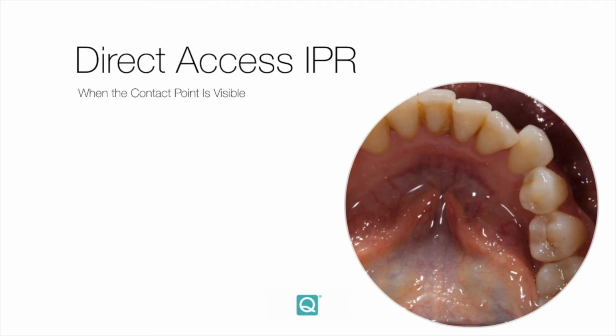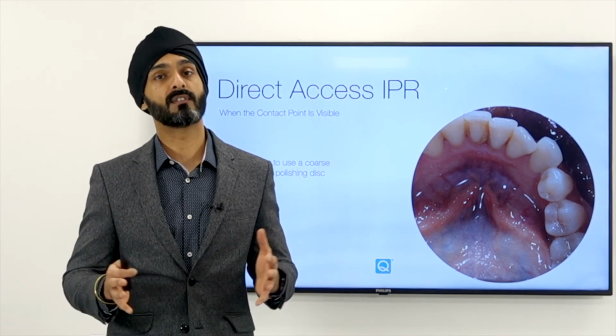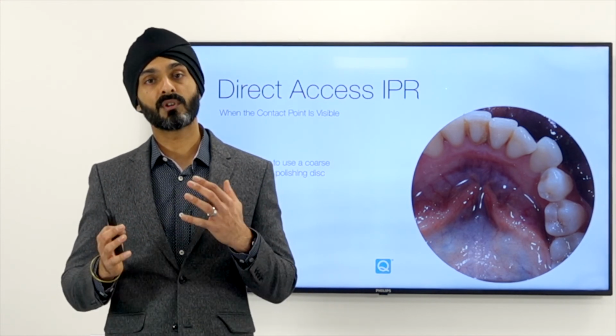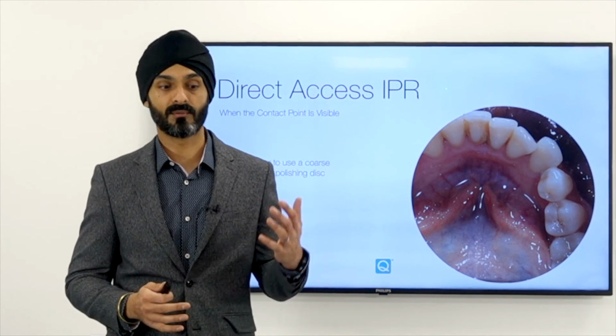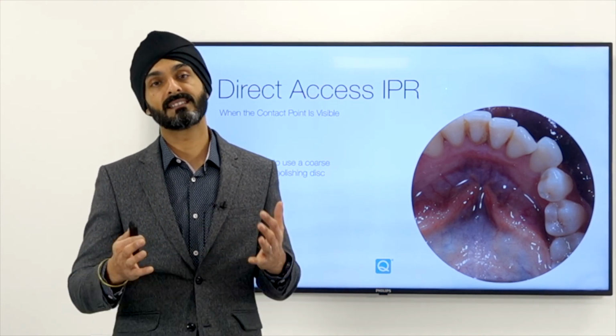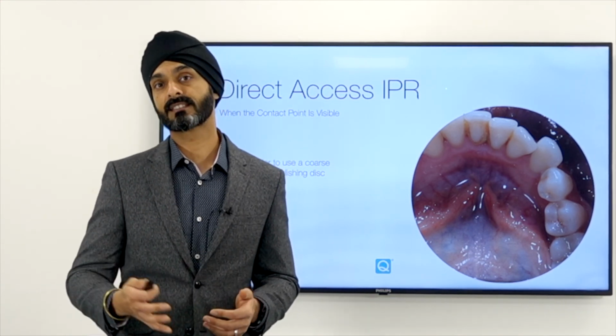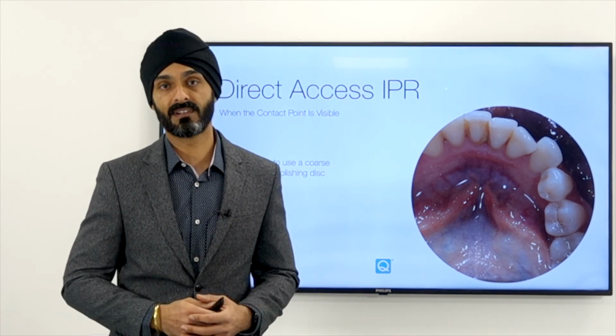When you've got a contact point which is completely visible, like on this lower right 3, it's easier to use a coarse polishing disc to adjust the contact points of that tooth rather than using a strip. So when you do this, it's a good idea to use a full series of the soft flex discs, because this will give you a much more polished enamel surface once you've finished, reducing any chances of friction between the teeth. It also is a much better way to leave the tooth, because a smooth surface is much more protected against caries as well.